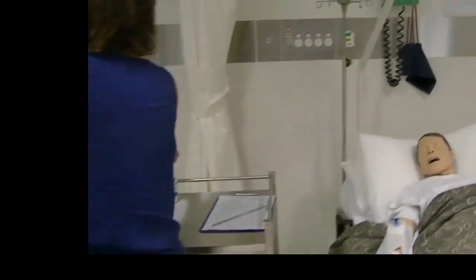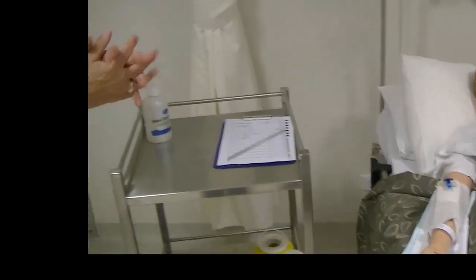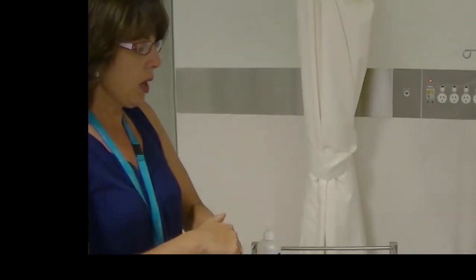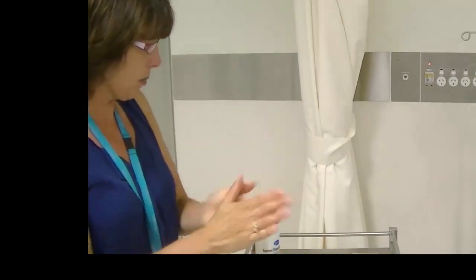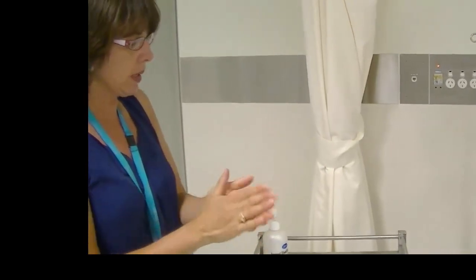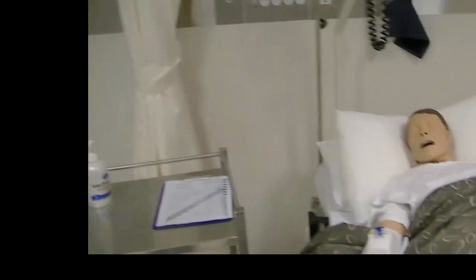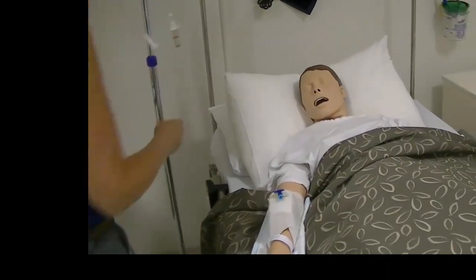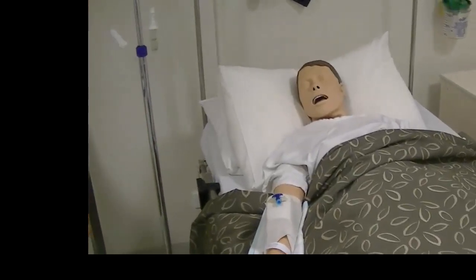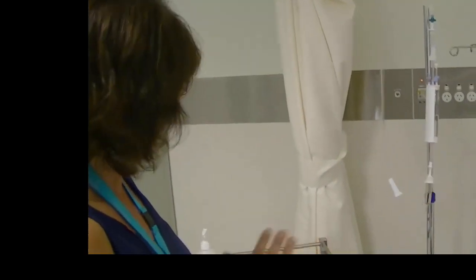Hi Jessica. I'm Heather, I'm your nurse today. You've got to have some IV antibiotics through your IV cannula, so I'm going to connect up the IV line with the fluid to the cannula. It's been ordered by the doctor. Have you had this done before? Yes. Okay, so you know that this IV flask will continue running until it's finished and I will monitor it. And we'll give the antibiotics later on. Are you okay if I proceed with this?